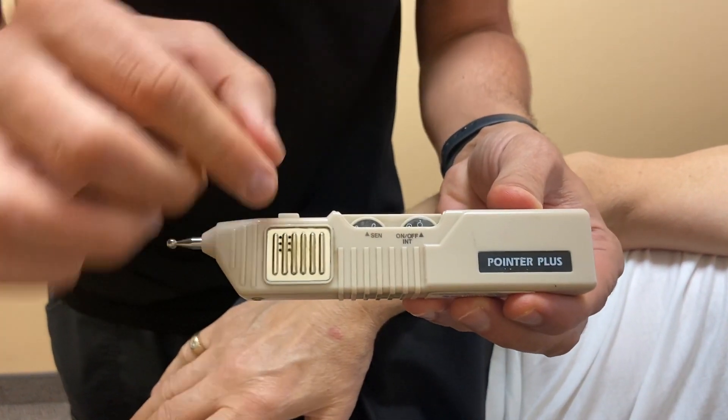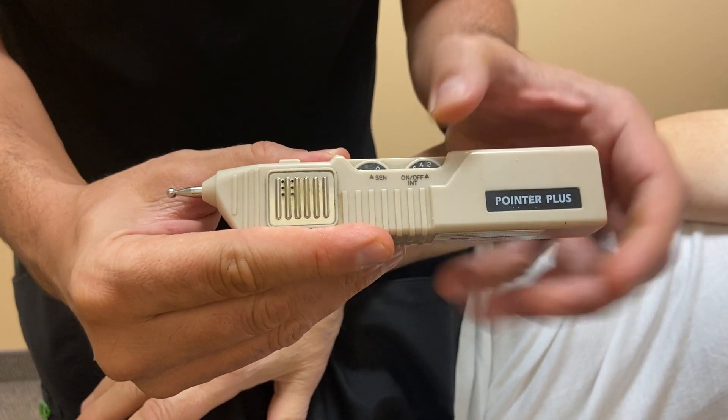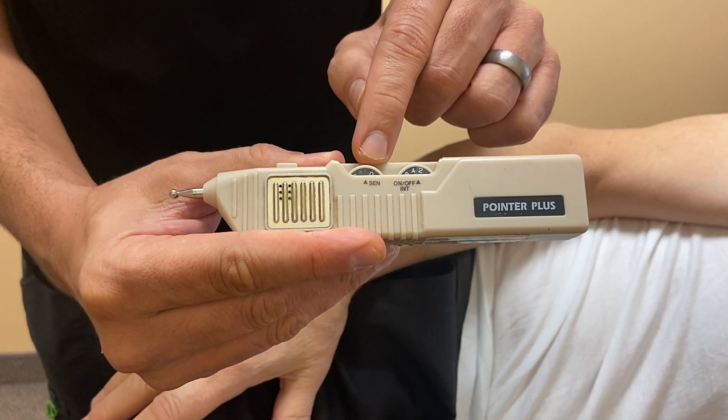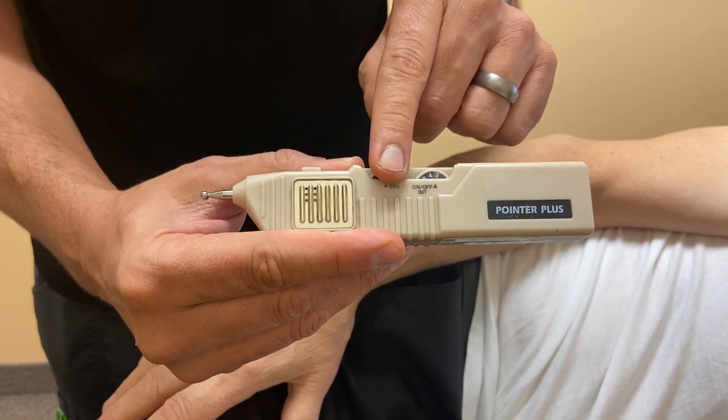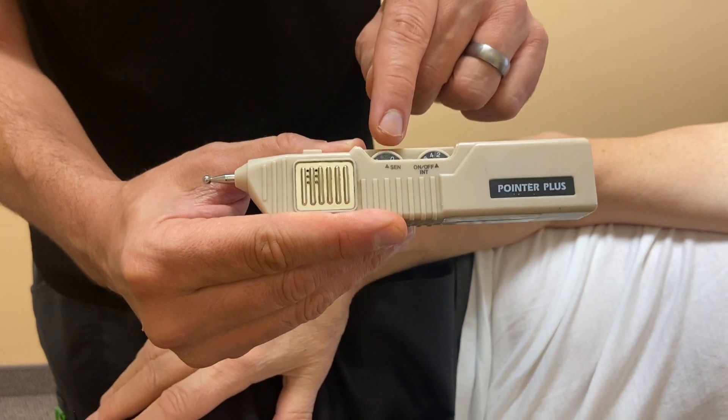A couple of things we need to know. This dial turns things on. This is the sensitivity dial, and for the purposes of motor point acupuncture, ignore it. You'll see some pointer pluses that actually don't even have this dial.